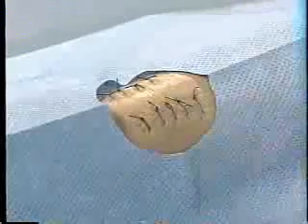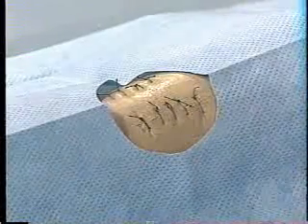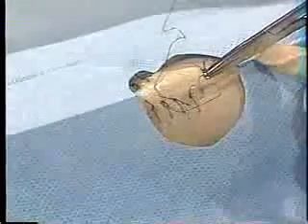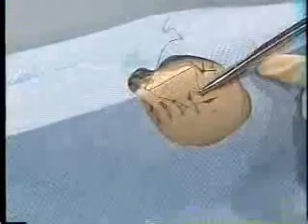For nylon or other monofilament suture, perform 4 or more square knots, leaving no daylight between the knots. You want the knots to be tight and square, but you don't want to crush the tissue with the suture.